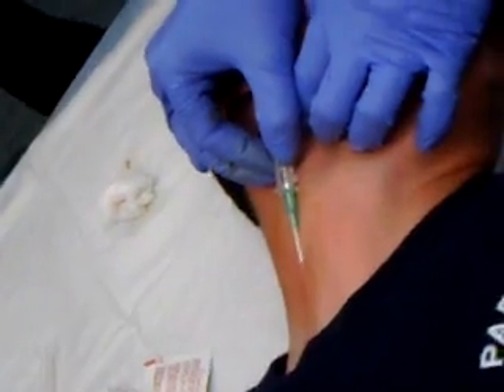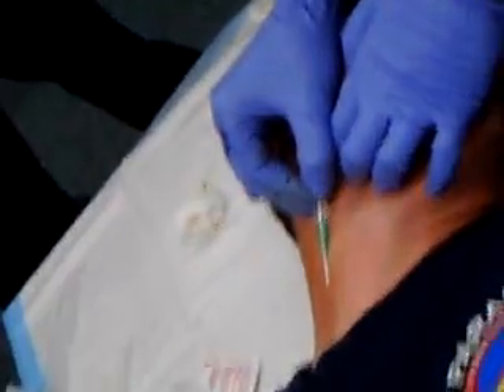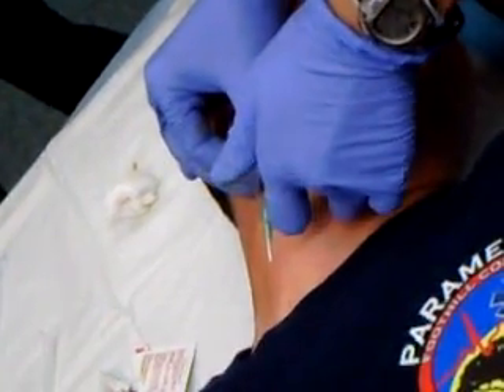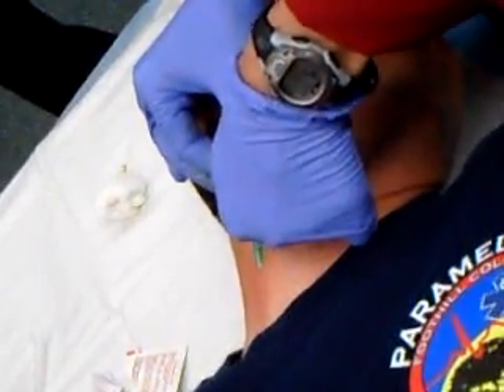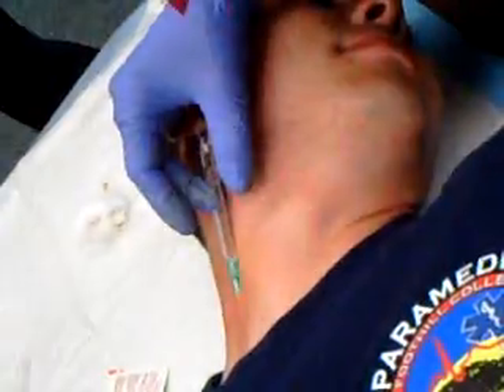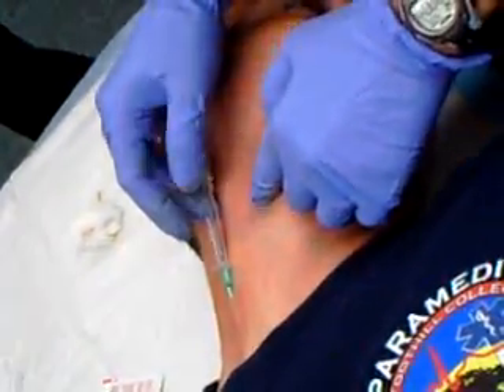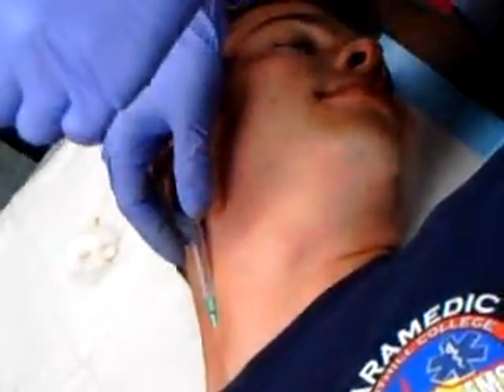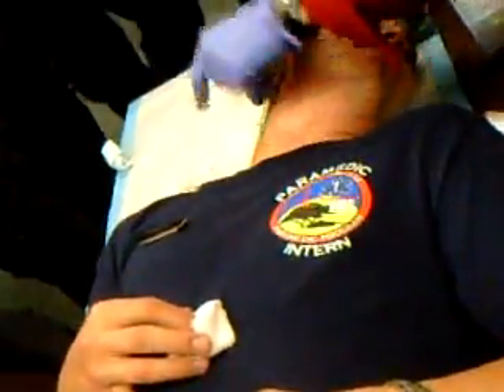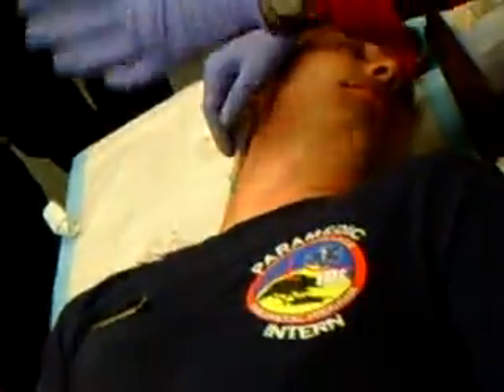That was really cool. So I'm in there, right? But I need to go a millimeter. So I just do it a little bit. I'm still holding traction. Notice where my finger's at as I advance the catheter, and then I hide the needle. The reason I want to still hold traction in the skin is that when it goes in there, it's still attached to the epidermis and it's just inside the vein. So if I let go of the traction, the needle will actually lacerate the vein and I'll come out. So you notice that when you do those IVs on each other.